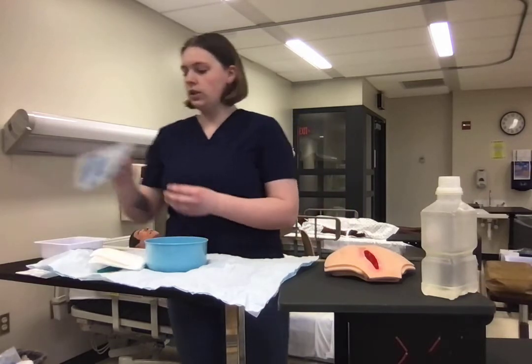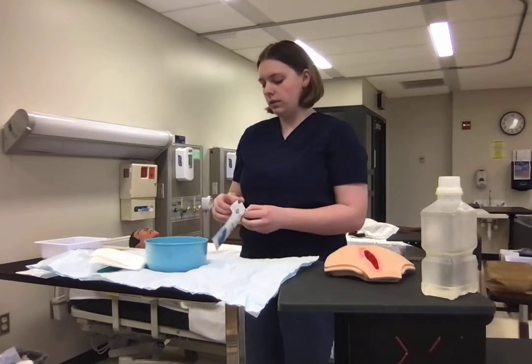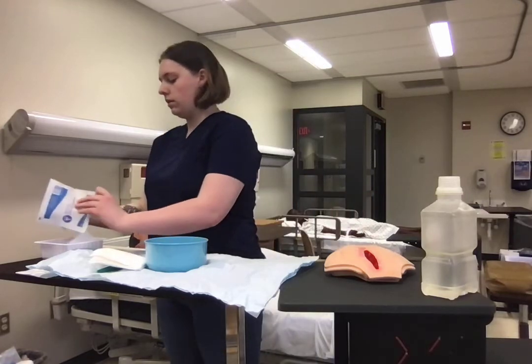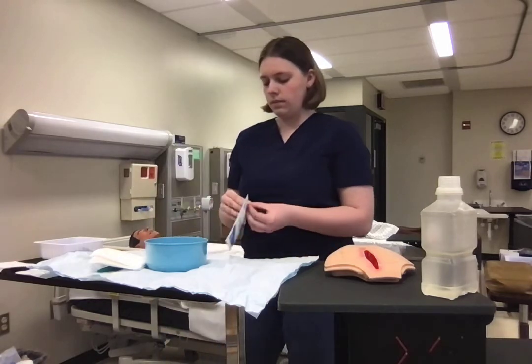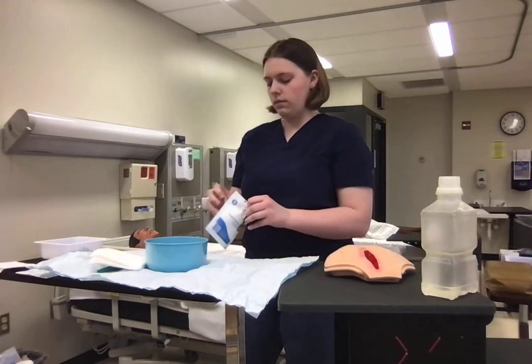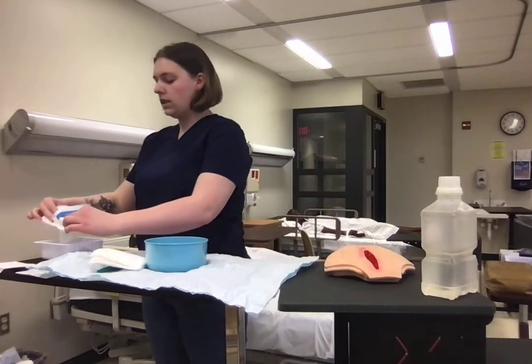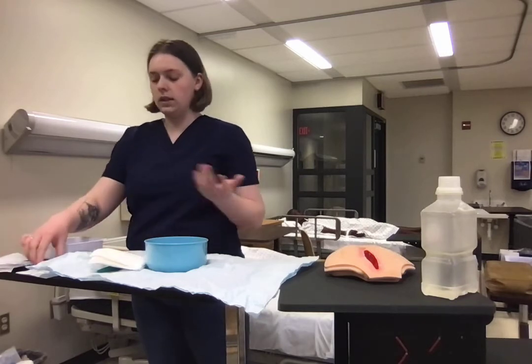I'm also going to peel open my surgical sponge gauze, and I'm going to dump them in my gauze boat. I will set those to the side. And I'm not touching this gauze with my hands, so they remain sterile.